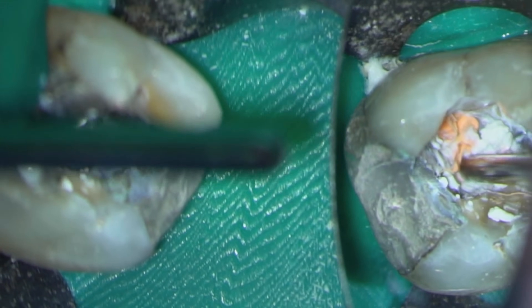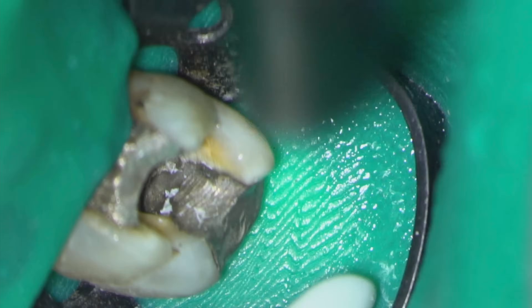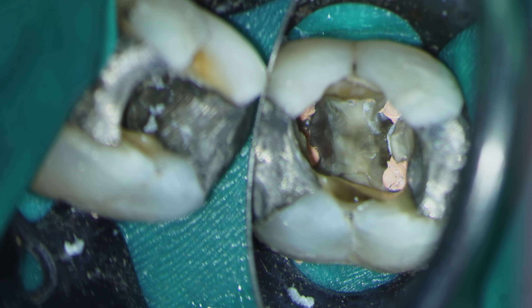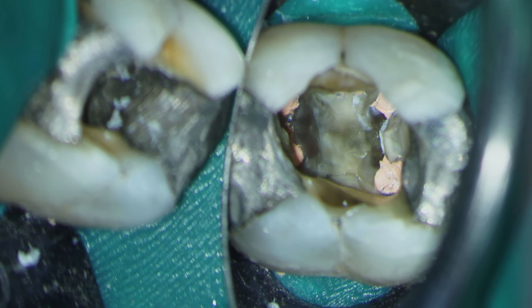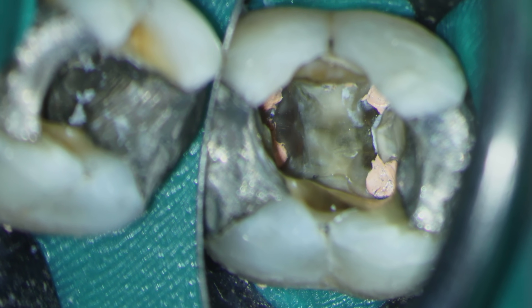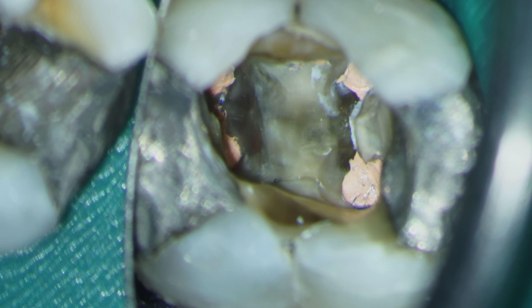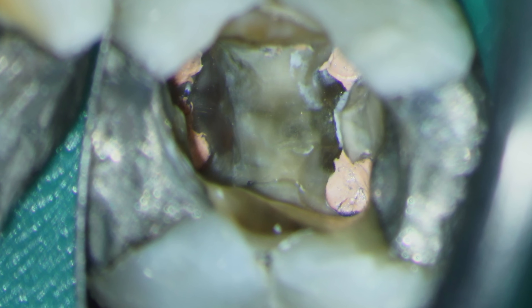It's all a bit mucky down there but it's very easy with BC sealer to clean up. I'm going to finish off the GP with an LN burr and then simply wash out the access cavity with a three-in-one tip. Some of you may be wondering why I didn't remove the entire amalgam restoration in this case. It's partly because the referring dentist is an excellent prosthodontist who likes to create their own core. But also it means there's a pool of hypochlorite through which you can work during preparation, which is key to keeping any dentine debris in solution and preventing blockages. Here you can see the pulp floor nice and clean ready for restoration; in this case I placed some Ketac Fuji 9 just to seal the access cavity before the prosthodontic specialist restored the tooth.